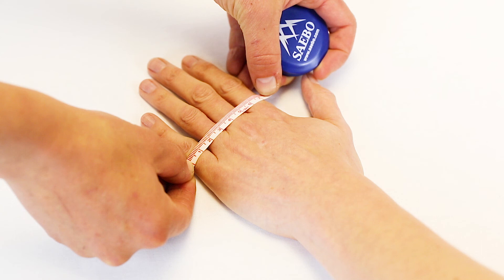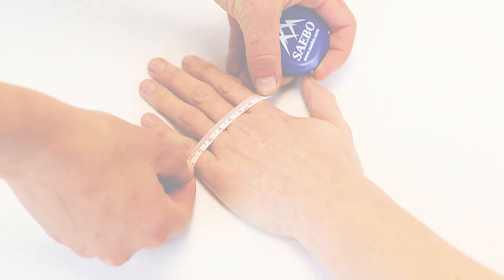If the measurement is between sizes, choose the larger option if your fingers are of average or longer length.